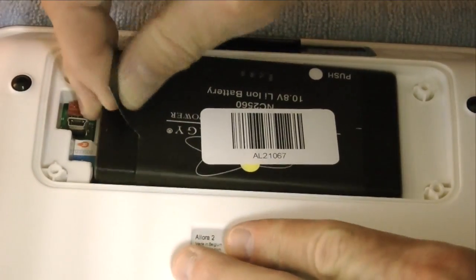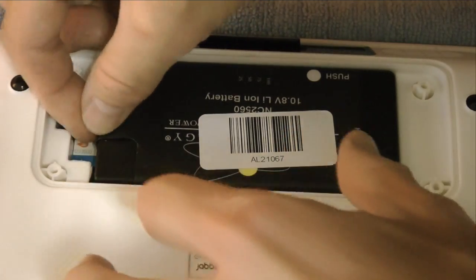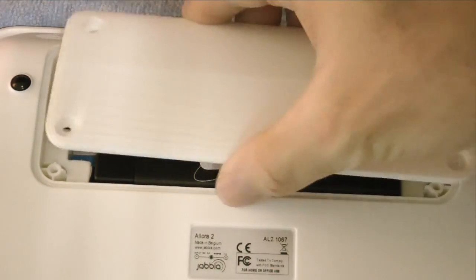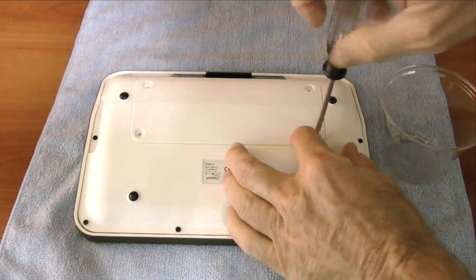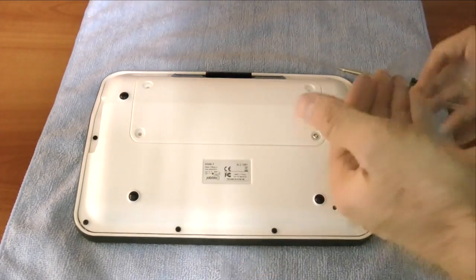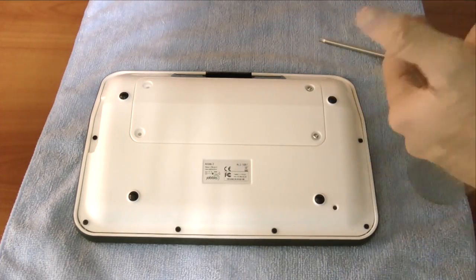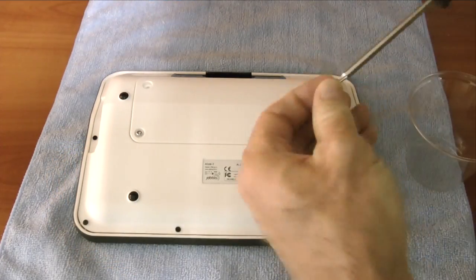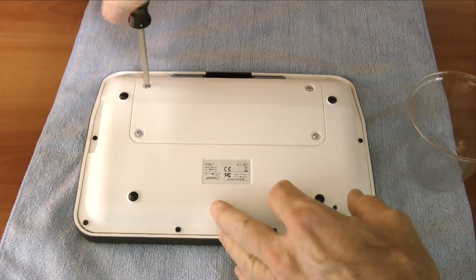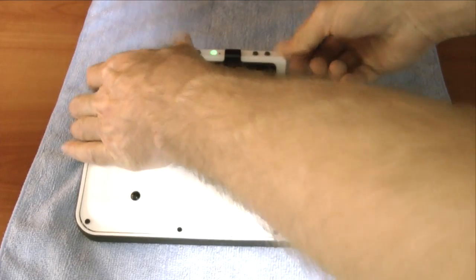Install the new internal battery. Fold over the ribbon cable on the left-hand side of the new battery. Put back on the battery cover. Using the Torx number 10 screwdriver, reinstall the 4 Torx number 10 battery cover screws. Reinstall the ADI wireless module previously installed. Turn over the Allora 2.